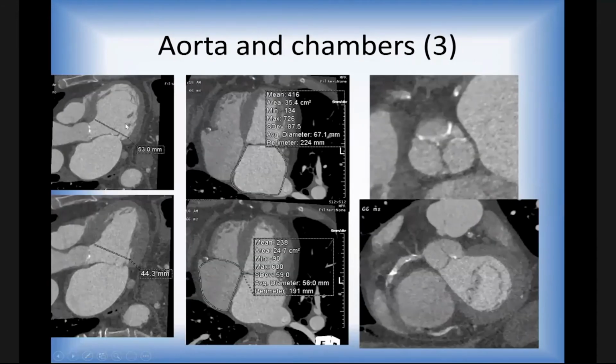And then this is how we measure the chambers, the size of the cardiac chambers. This is pretty useful for the coronary CTA. You can see almost everything. And this is the aortic valve, which has calcification and aortic stenosis here, very thick. We also have a peek of the mitral valve here too. This is coronary artery disease. This is from different patients. I just want to show you how much the CTA can do.